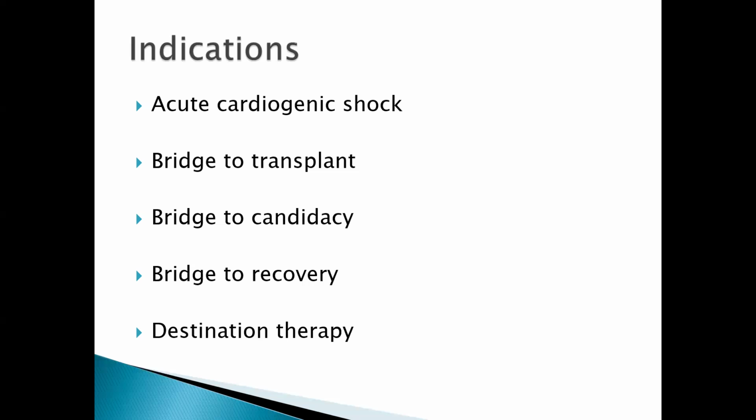There's a contraindication, but this device will help the patient improve his cardiovascular status to a little extent. Bridge to recovery means that this patient's native heart failed, but when you place this patient on this device therapy, the heart improves on its own. And whenever you remove this device, the patient gets near total recovery of function.